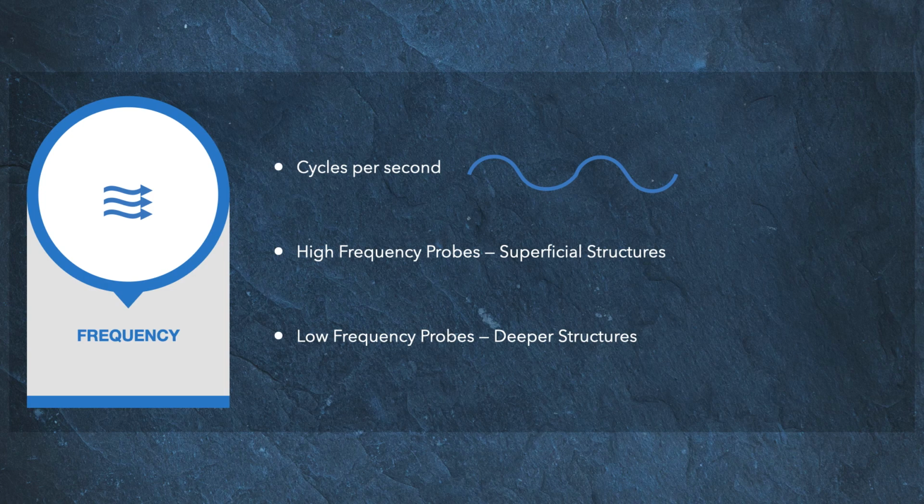Ultimately, higher frequency probes, or settings, are reserved for superficial structures as they provide incredible detail and demarcation between different tissue layers and structures. As such, high-frequency probes are typically reserved for procedural ultrasound, vascular, MSK, and soft tissue applications. That said, given the incredible detail, they can also be used to take a closer look at things like the peritoneum, appendix, and early pregnancy, as well as some lung ultrasound.